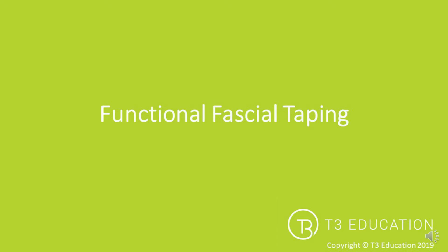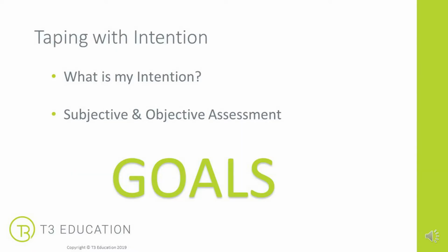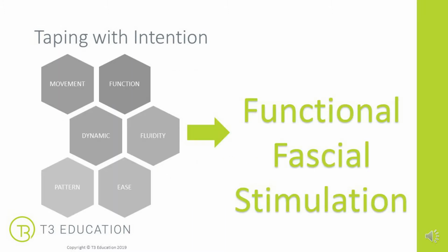Let's look at kinesiology tape for functional fascial retraining. If we look at our intentions and what our goal of treatment is, this is where we're looking to stimulate the fascia in a certain position, a certain movement pattern, to create better function in the tissue. So the key words we come to are things like movement, ease, repatterning, where we look to create dynamic, fluid motion in a functional way. That's where we're looking to use kinesiology tape with a goal of stimulating the fascia in a functional pattern or train.